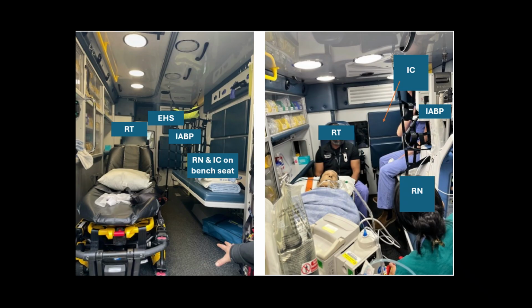Once the patient and the IABP are loaded, staff will need to find the seat most appropriate for their role. There is limited seating in the ambulance as the IABP is secured to one of the staff member seats. This means that in smaller ambulance, there will only be room for one RN, one interventional cardiologist, and one RT or another team member.